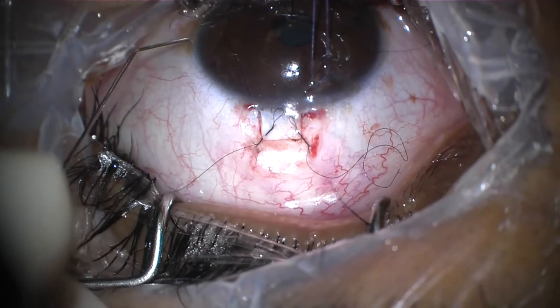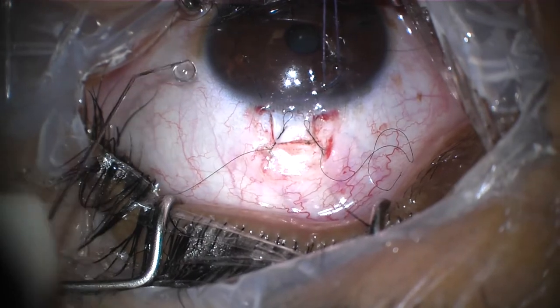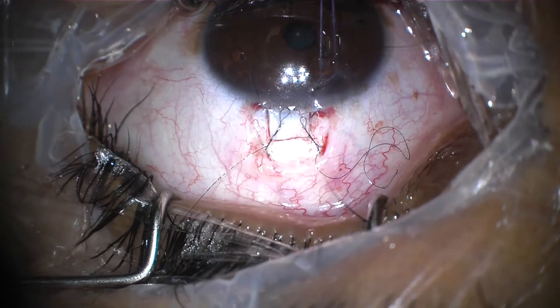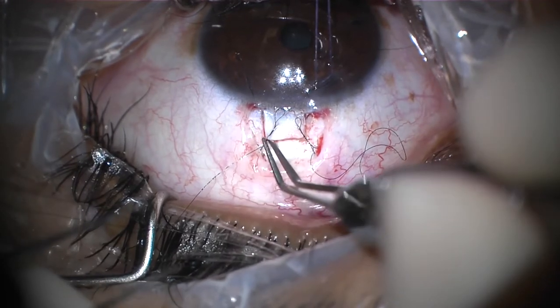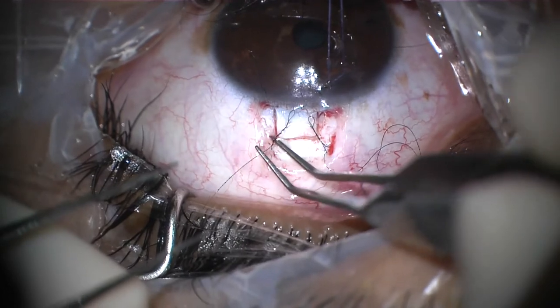Adjusting the other suture to the appropriate tension. Installing a balanced salt solution in the anterior chamber and checking the flow through the flap. Then loosening the suture to get more flow.